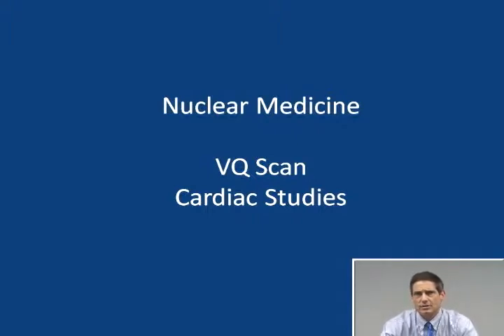Nuclear medicine studies also include infarct avid imaging, but those aren't done much anymore. That test has been largely supplanted by serial enzyme evaluations. And also myocardial perfusion studies. You can perform those at the time of a supposed cardiac event in equivocal cases, but that's not really the most common way that those studies are used. More typically, they're done with a stress test in patients who have clinical features suspicious for coronary artery syndrome.